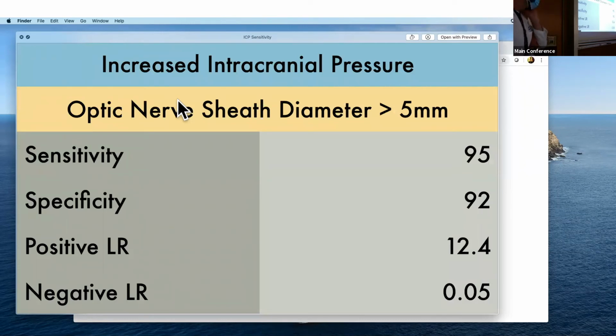Certainly, when I was a fellow, I remember hearing about optic nerve sheath diameter and being told it's useless. Don't even bother, you can't incorporate this clinically, it's not ready for prime time. So it's fun when Alina and other people come up to me and say, "Wait a minute, I was reading more about that. Is there a way it could be used?" And then they have to go back to some of the evidence and think, "Well, wait a minute, maybe there is a way."